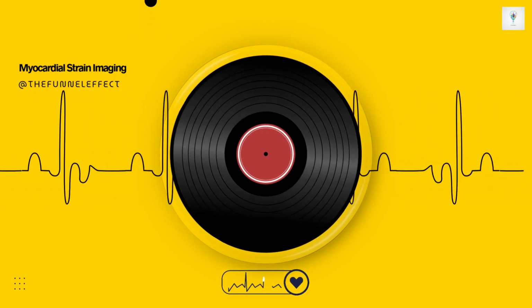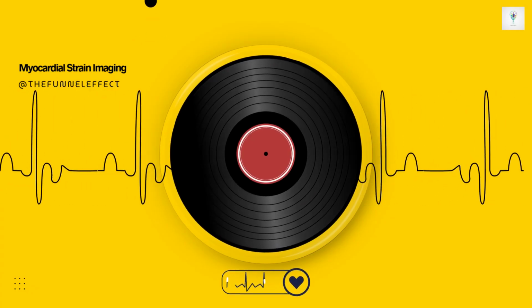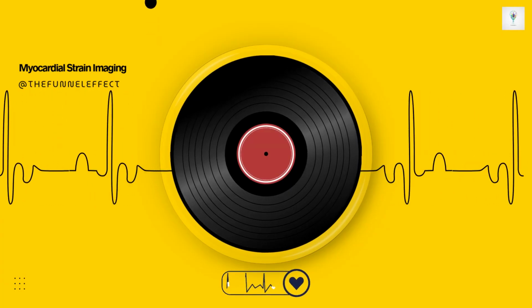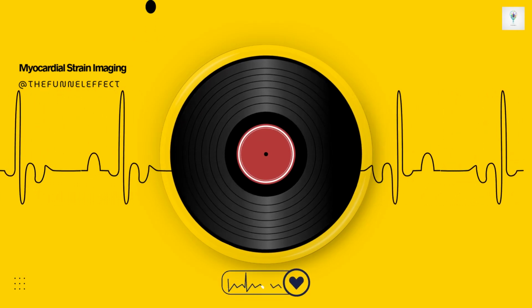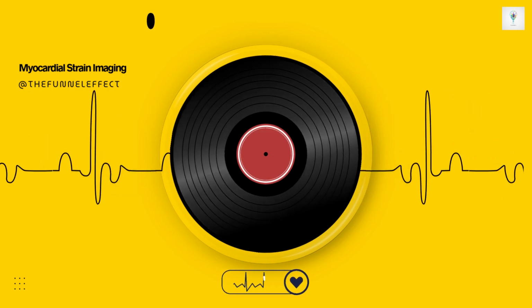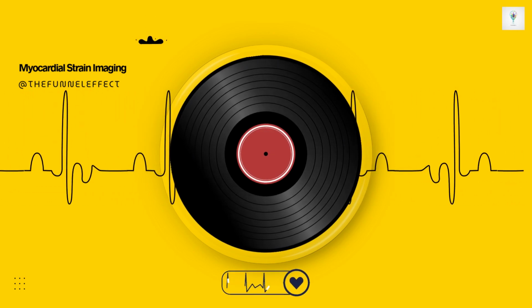Wow. And how do they track these tiny things inside a beating heart? Using high-speed biplane cineradiography, essentially, X-ray movies from two angles at once. This allowed researchers to track the 3D movement of those markers and derive the true deformation of the myocardium. So those invasive methods became the benchmark. Exactly. They became the preclinical gold standards. Any new non-invasive method that came along had to be validated against these techniques.